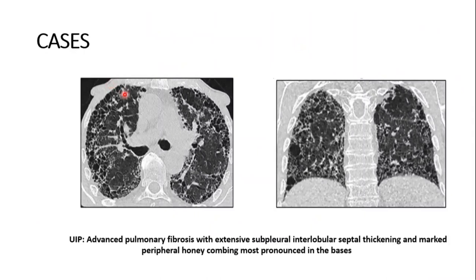The first case is usual interstitial pneumonia. The classical CT findings in usual interstitial pneumonia are presence of reticular opacity with honeycombing, with or without traction bronchiectasis. All should show subpleural and basal predominance. This case demonstrates the presence of honeycombing with peripheral reticular opacity, which is subpleural and basal predominant, which is typically present in UIP pattern.